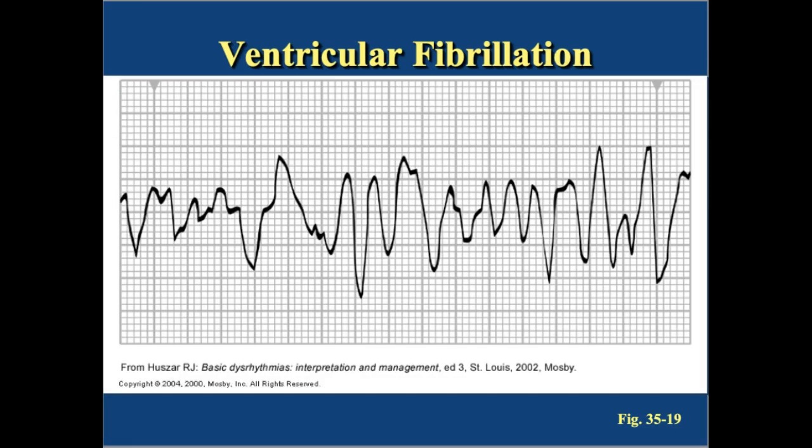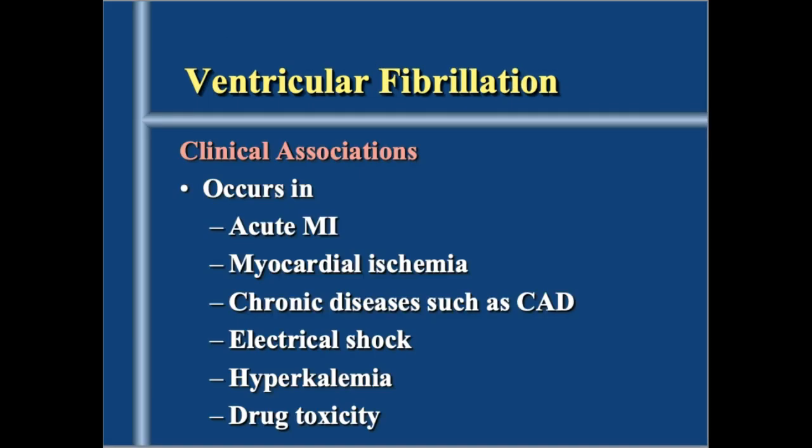So this is an example of VFib, although you'll often see it even more disorganized than this. And again, I shouldn't have said you're dead with VFib. You have no cardiac output with VFib, and you are on your way to being dead. We are doing compressions. We are doing everything we can to get your heart back into a regular rhythm. The very first thing we're going to do is defibrillate, because we really need to get this rhythm stopped so that your heart can start back up into an organized rhythm and give you some life-giving cardiac output.